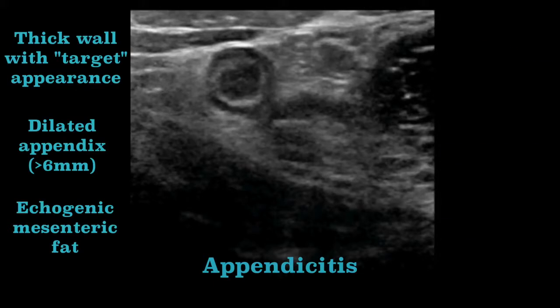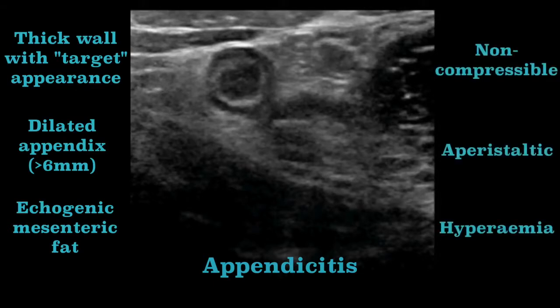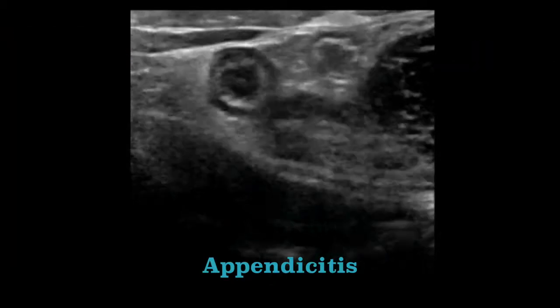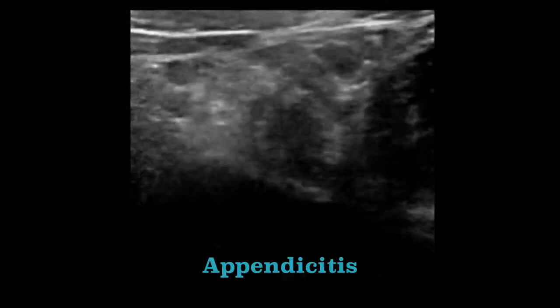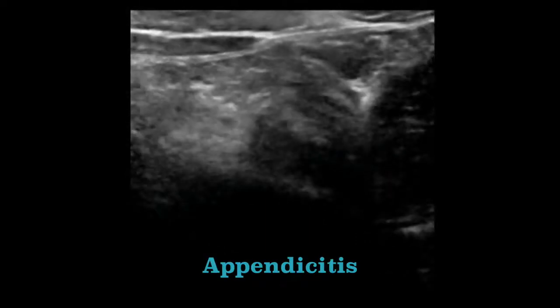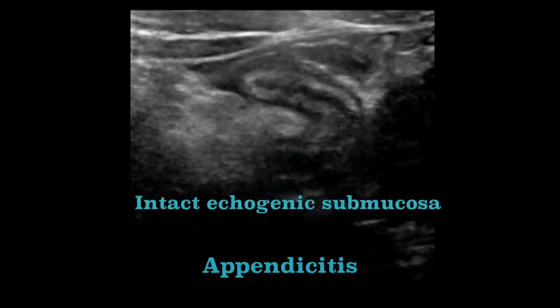But there are even more things to note with ultrasound. As ultrasound is a dynamic test, you can also look for compressibility and for peristalsis. The absence of both of these features further suggests appendicitis. Color Doppler assessment allows you to look for hyperemia, which is another useful supportive feature. In this example, we can see that the submucosa, although echogenic, is intact.